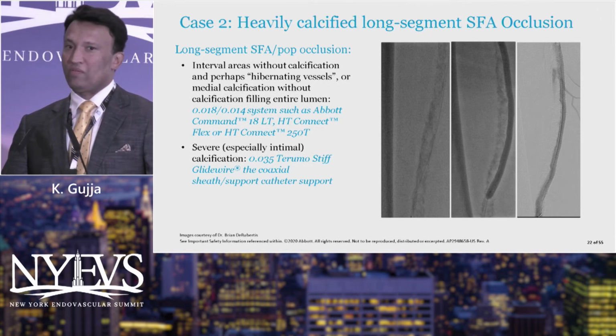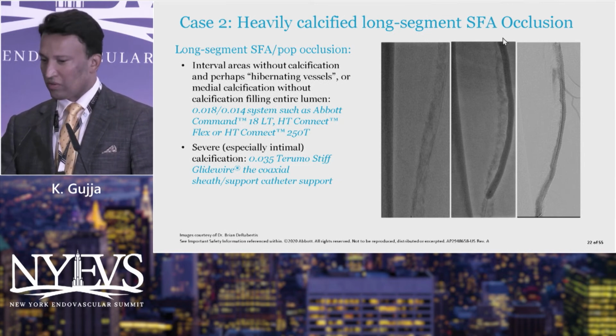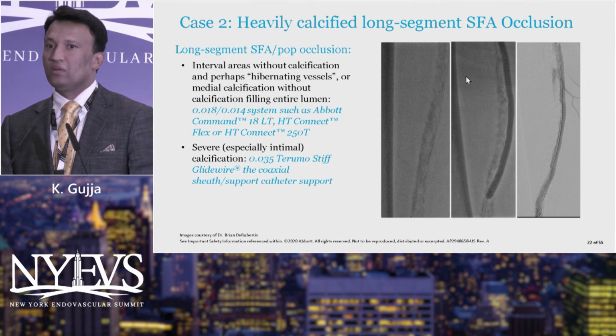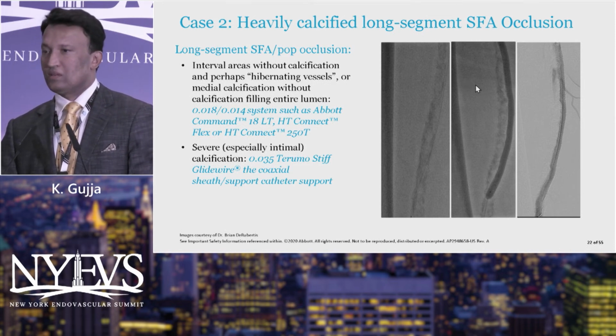So try not to, if you have a long segment like this case, as you just see, it's a 40 centimeter CTO. Trying to be intraluminal in this calcified vessel really doesn't make any sense.